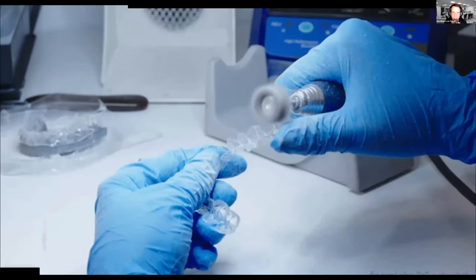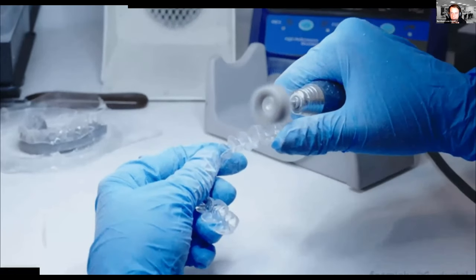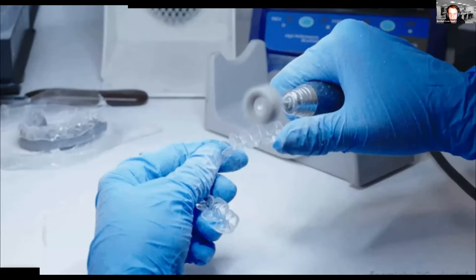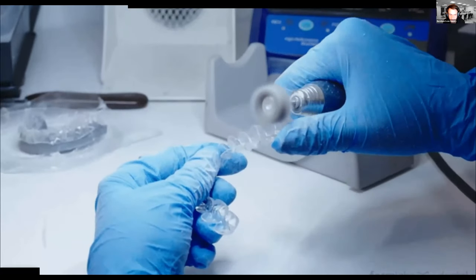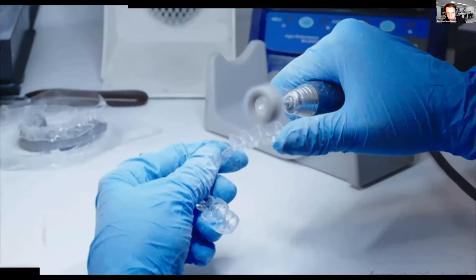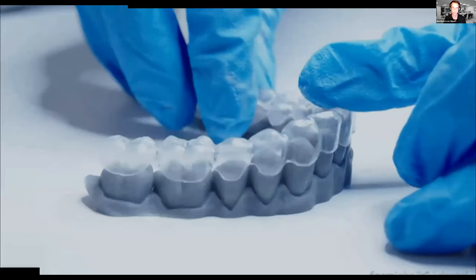For polishing, we recommend using special polishing wheels for thermoforming sheets, because polishing produces very much heat. And with traditional silicone polishers, you will just melt it. You can also do polishing with pumice and water in the really traditional way. In this case, you even have the cooling effect of the water on the sheet. There are two methods to do the polishing. One is doing it in a handpiece, or the second one is going directly to the polishing motor. This is up to you and up to how you learned to do this. So then you have to polish the edges and you're done.